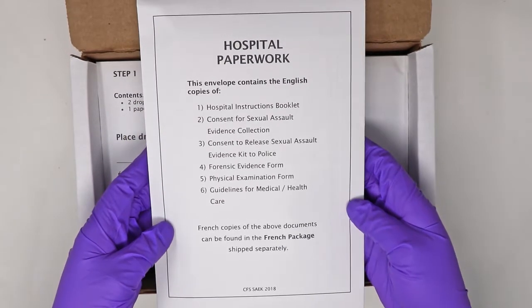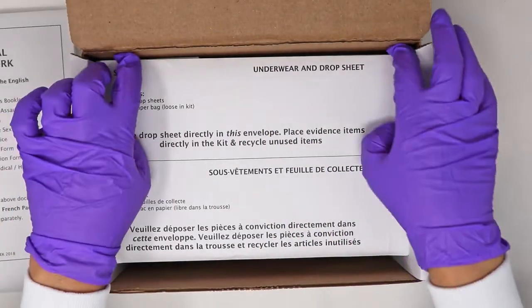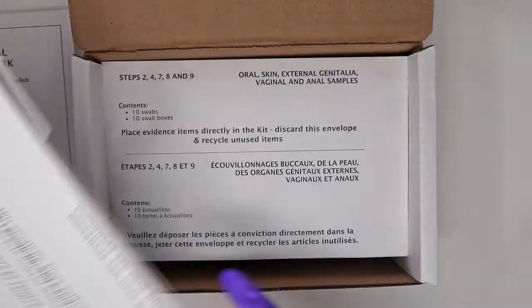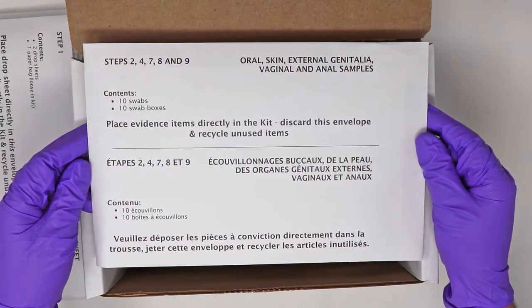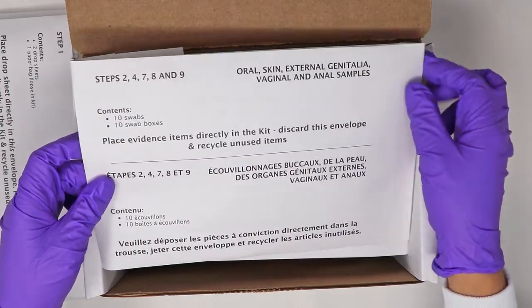The kit contains hospital paperwork, which will be discussed in greater detail, as well as envelopes for each of the steps that are detailed for the collection of evidence. Swabs are contained within one envelope, as well as swab boxes that permit the collection of steps 2, 4, 7, 8, and 9.